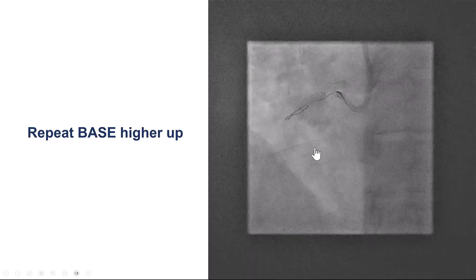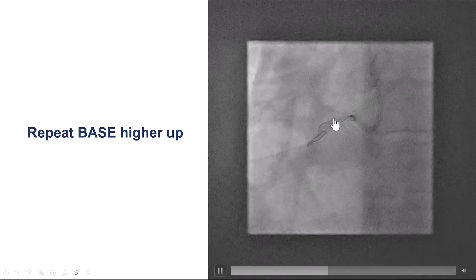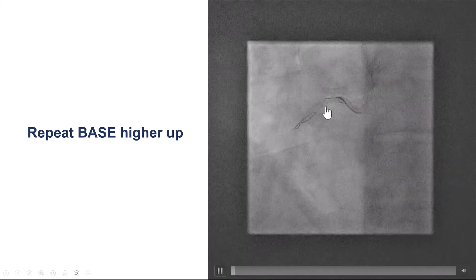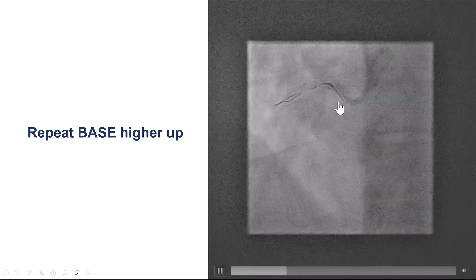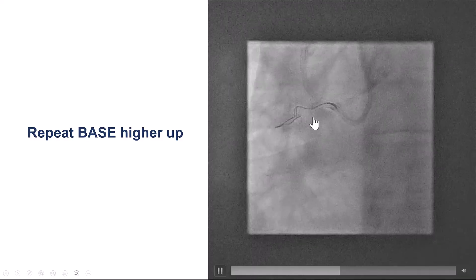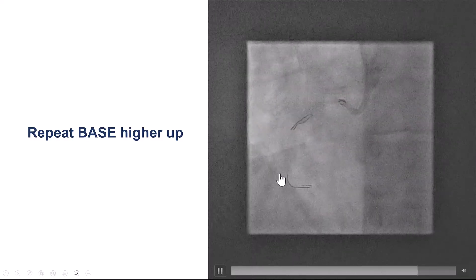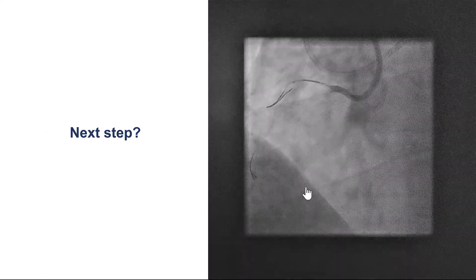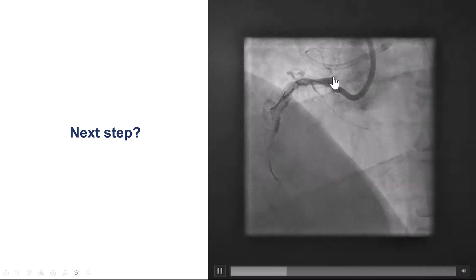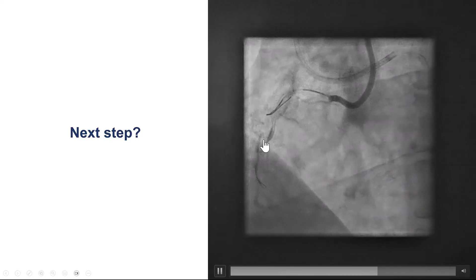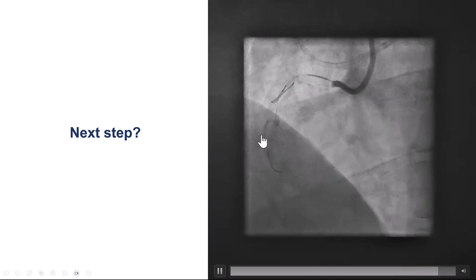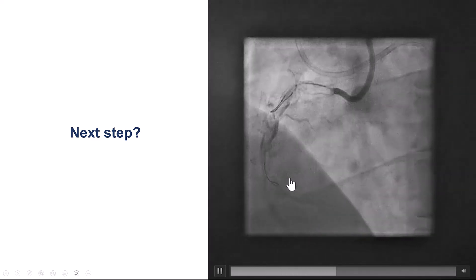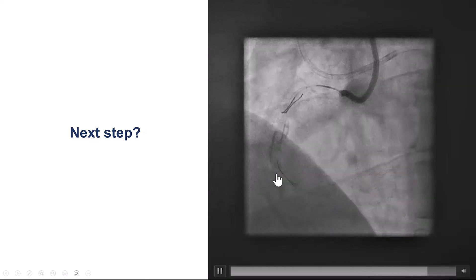We had difficulties and lost wire position, so we repeated the process, this time starting the dissection a little more proximal. The guide wire — again a Gladius Mongo — wraps around the balloon, wraps around the vessel, and gets into a vessel, which is probably one of the acute marginal branches. We did do an antegrade injection, even though we typically avoid this in ADR, but had no other way of visualizing. The wire is confirmed in one of the acute marginal branches at the distal cap, the more superior one.